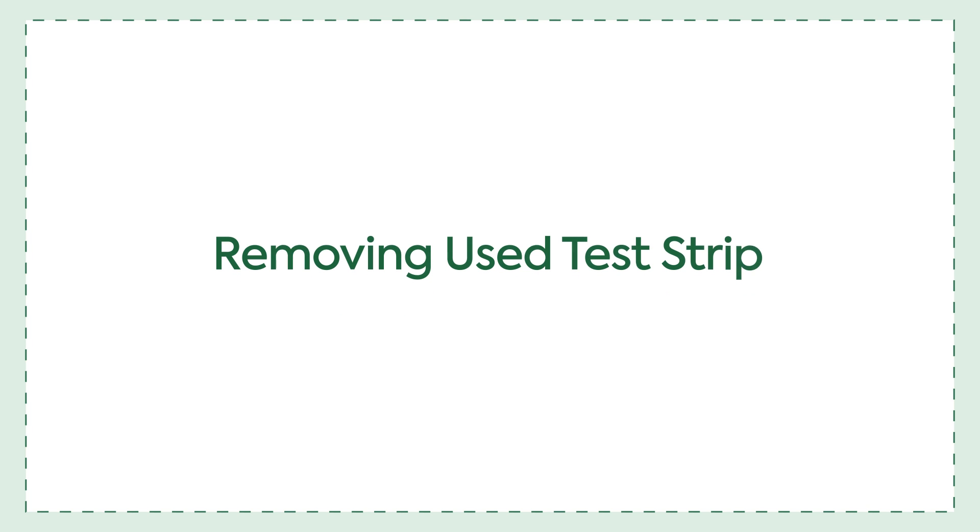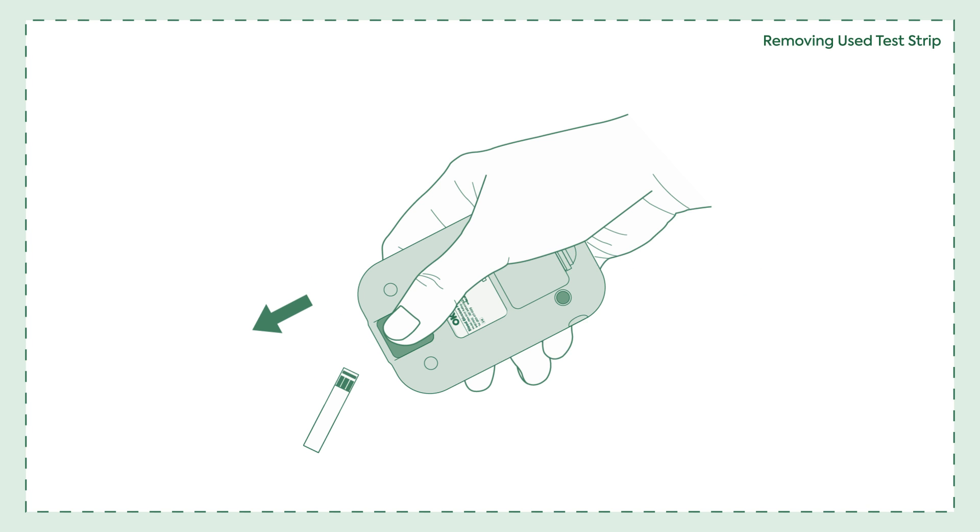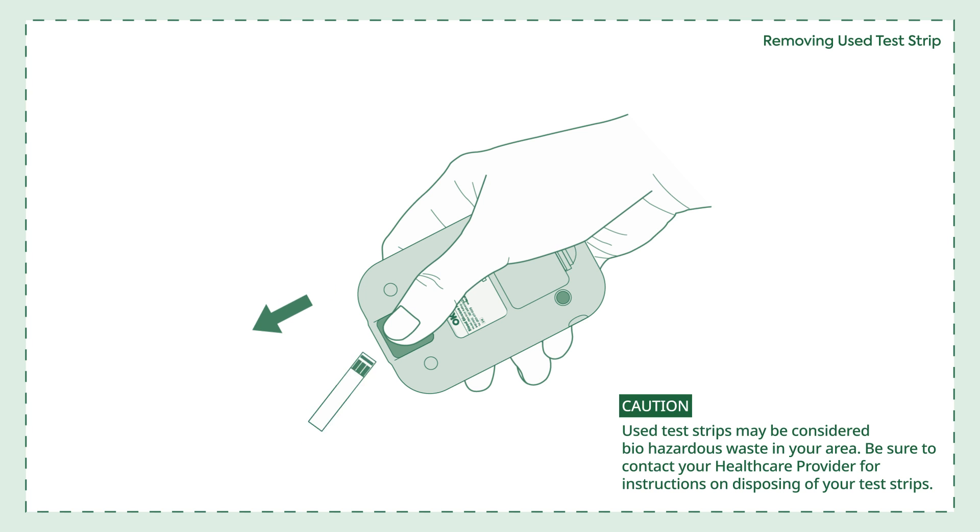Removing the used test strip. Once the test is complete, push the ejector button forward to remove the test strip from the meter. Used test strips may be considered biohazardous waste in your area. Be sure to contact your healthcare provider for instructions on disposing of your test strips.